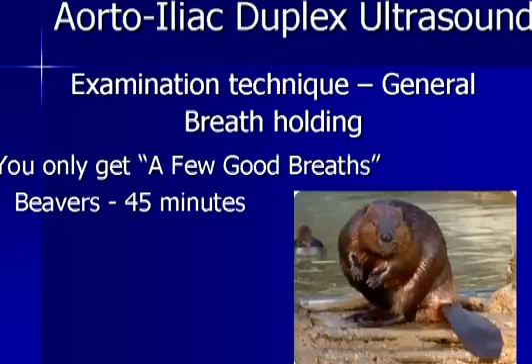A few more comments about breath holding. You must remember that you're dealing with patients who will only give you a few good breaths. Now, if all of our patients were beavers, life would be good. A beaver can take a breath in, you can do your study, about 45 minutes later the beaver needs to take another breath, but you have all of your data complete and your study is finished by that time.